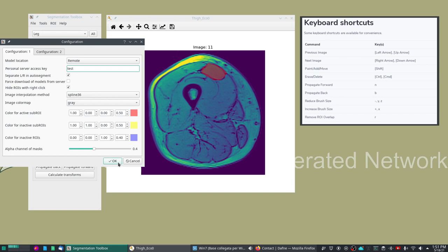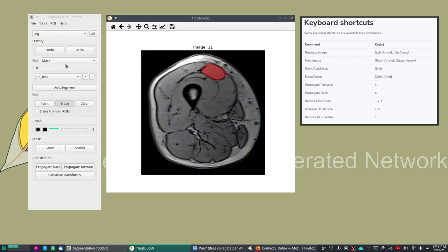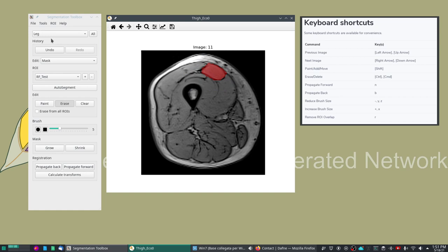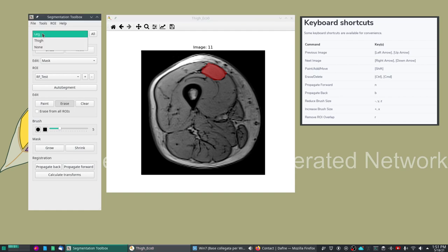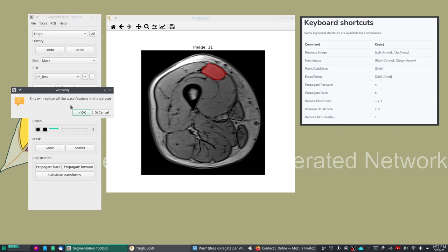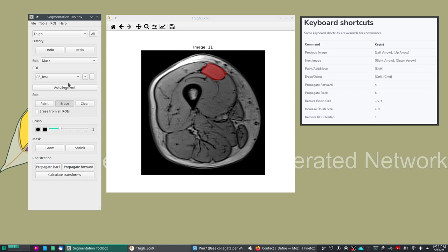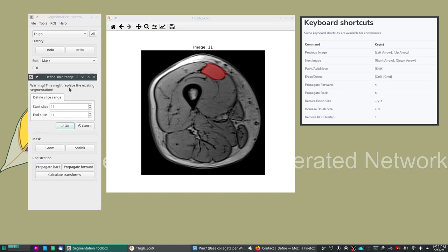The personal server access key is now set. Now we can proceed to run an auto segmentation of this dataset. We have to check, you see now that I used the preference, this is a small bug, the classification of the anatomy that is shown here has reverted to leg. We had selected thigh in the beginning so let's put it back to thigh and click all so that the classification of the whole dataset is thigh.